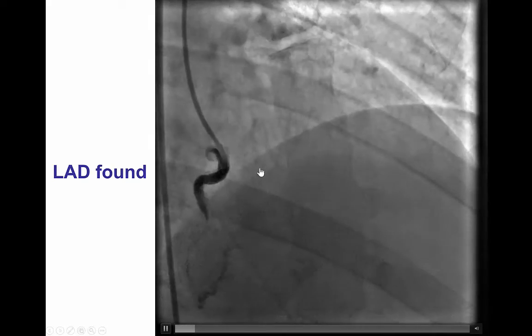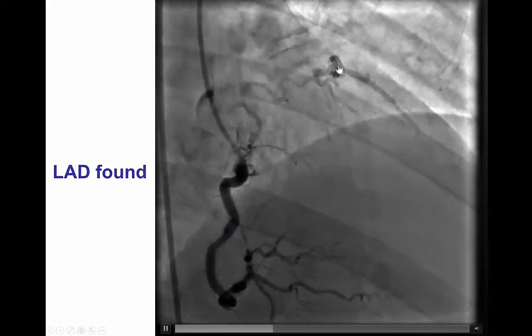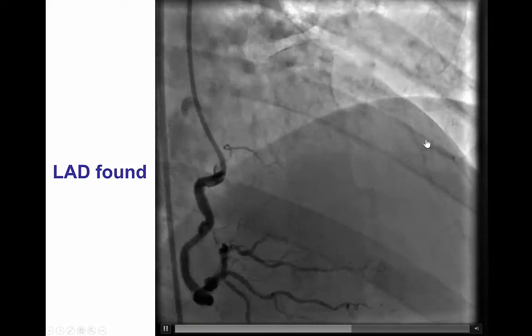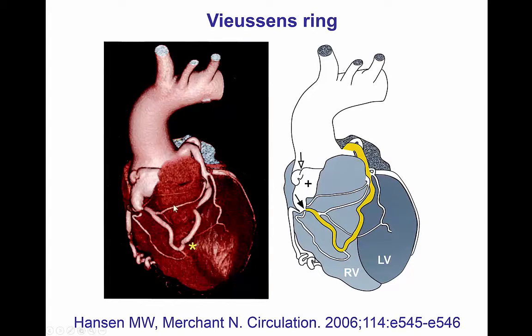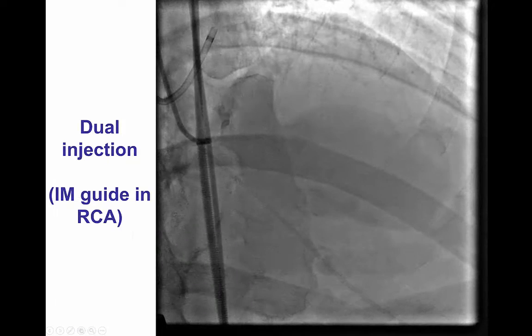This is essentially a vieussens collateral that goes from a conus branch all the way to the LAD. And this is another example of that — a proximal LAD collateral coursing over the RV and then supplying the left anterior descending artery. This is a good collateral to know because it originates proximally in the right coronary artery or can even originate separately from the aorta, and sometimes it may not be visualized during right coronary injections, as was the case in our patient.